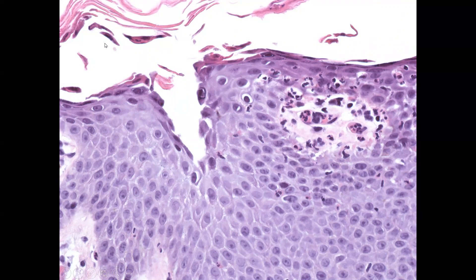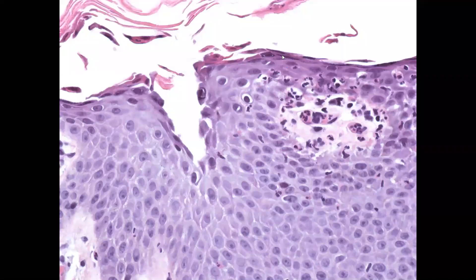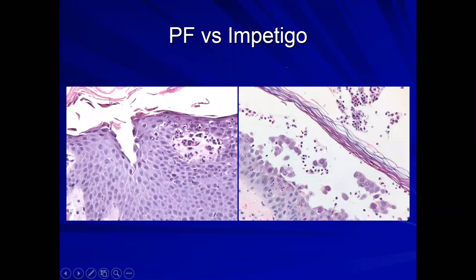This is pemphigus foliaceus, which otherwise looks very much like scalded skin. Pemphigus foliaceus also tends to retain the shape of the granular layer — the flattened squamous cells — whereas bullous impetigo tends to retain the roundness of the cells. The acantholysis is superficial and can be above the epidermis. If you see superficial acantholysis in your subcorneal split and cells retain a round shape, you would favor impetigo over pemphigus foliaceus.